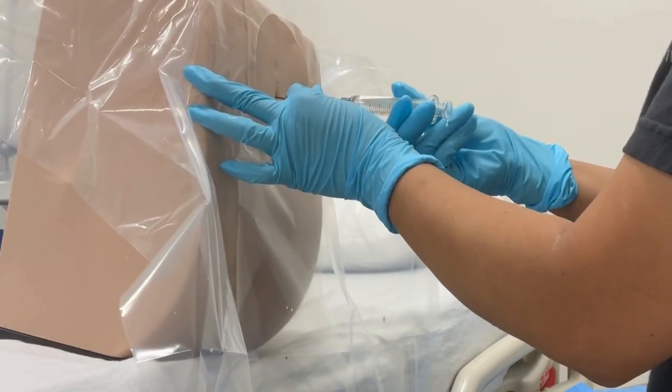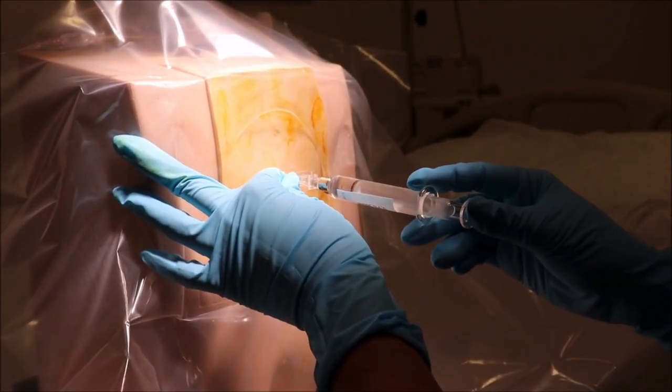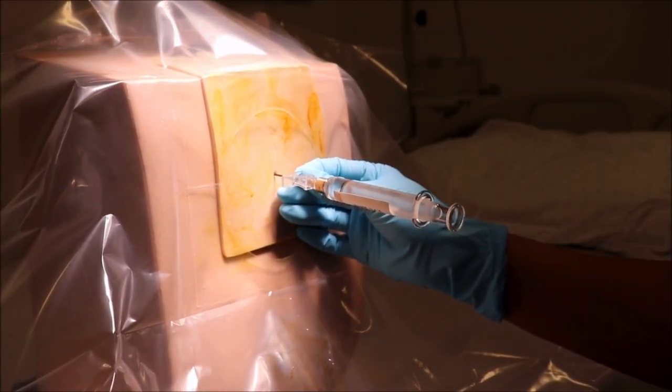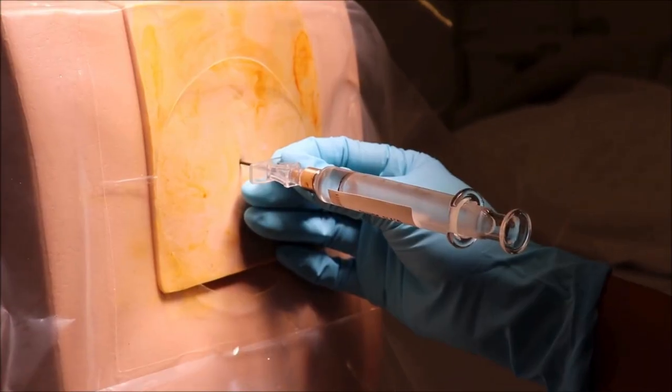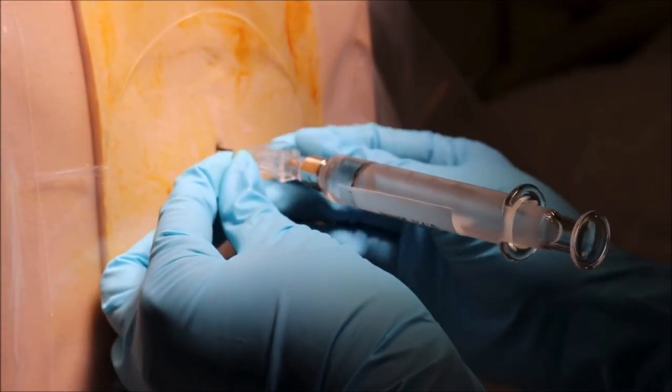I have loss of resistance right here. You can do either technique, but for saline technique, get rid of the air and apply continuous pressure on the plunger with saline only. When the saline goes into the epidural space easily, it confirms loss of resistance. Let's do a close-up of where our loss of resistance is and be ready for some calculation.